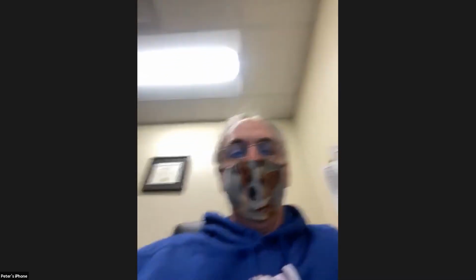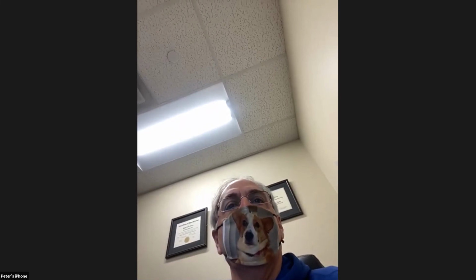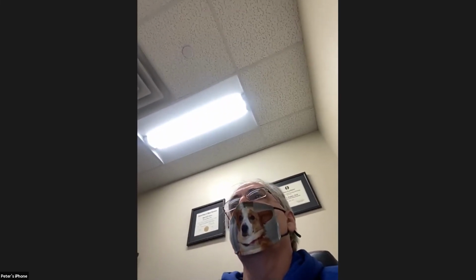Zayed, I have a question. I'm Mohammed. The slide that you showed that shows the total amount of time taken to do the scan, is this time presented on the last slide or which slide? It's represented on every single slide. So from the first image that's taken to the very last image, you can see that timestamp on each of the images. So how do you calculate the total amount of time taken to do the scan? Well, if the scan started at 7 o'clock, and the first image and the last image has 7:45 on it, then we know it took 45 minutes to do that scan. Got it. Thanks.